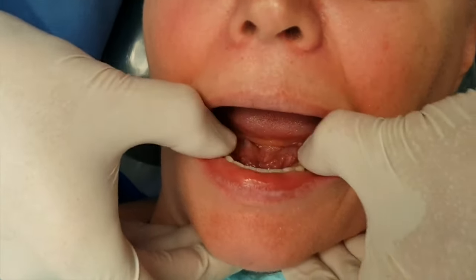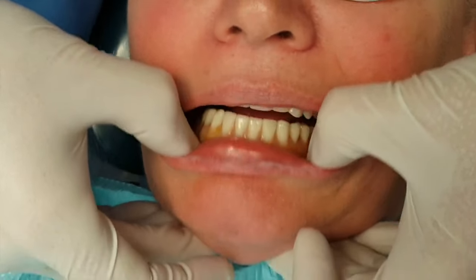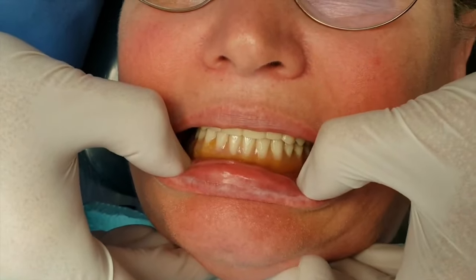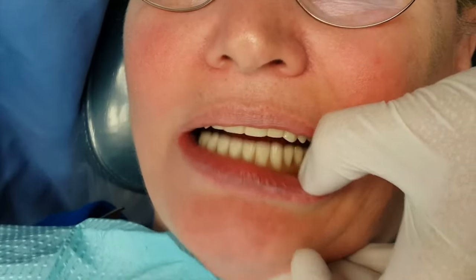Now let me know if it hurts — I'm pressing pretty hard of course. Go ahead and bite down. I want you to wiggle your teeth left and right, and back and forth, and chomp a few times.